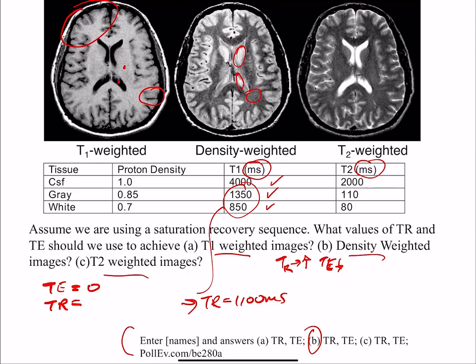Yeah, that's a good question. That's where I should have put the slides in for this time. But from last time, remember, we have two things that are decaying at different rates, and then the difference occurs at some point. The maximum difference occurs at sort of the average. So that's the intuition. For both T1 and T2, if you have two things that you're comparing and they're recovering at different rates, you take the average between the two, and that gives you the most difference. That's just a general rule of thumb. When we actually optimize these, we obviously use computer searches and simulations, and it's a lot more complicated. But for now, that's a good rule of thumb.